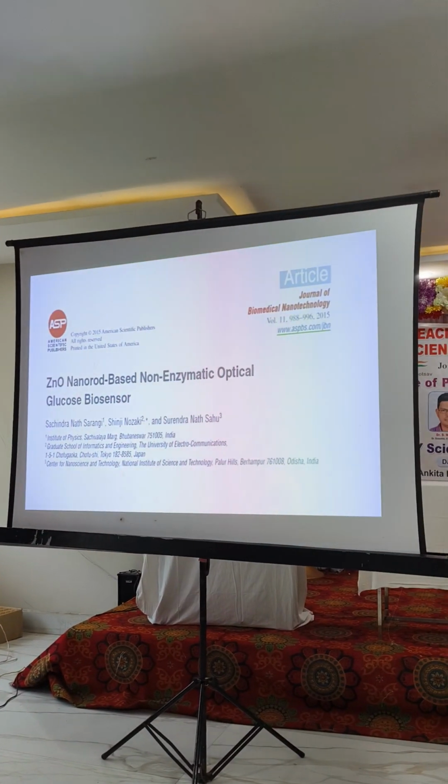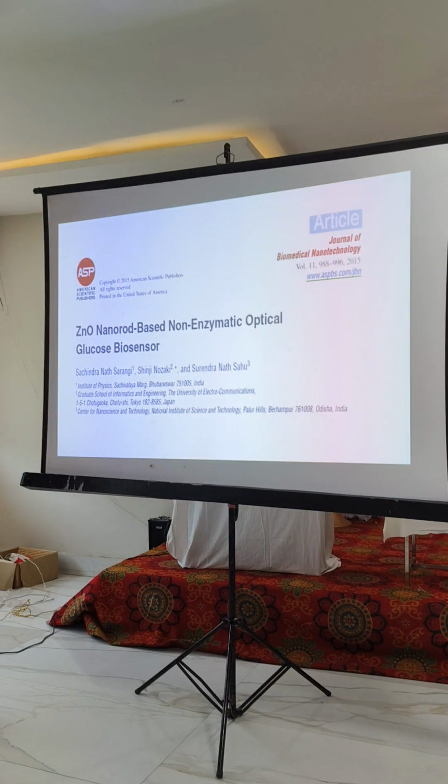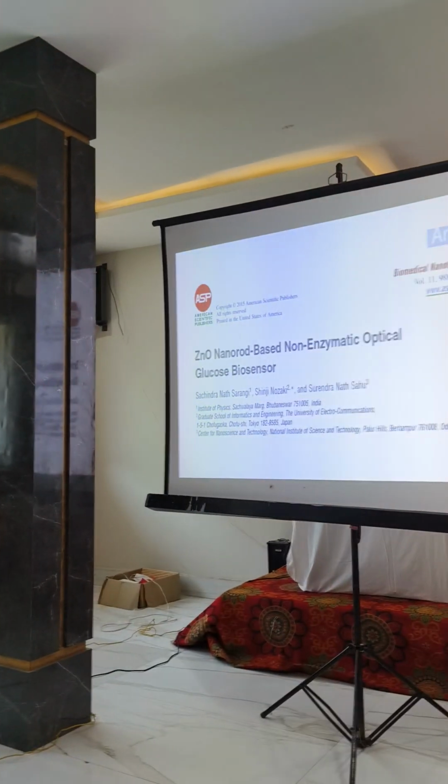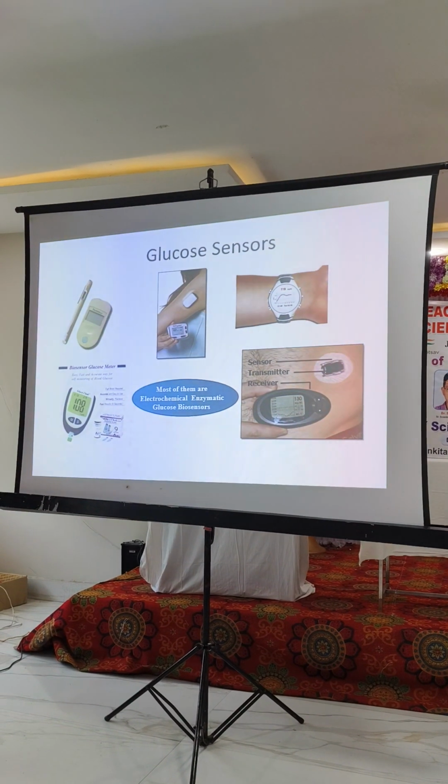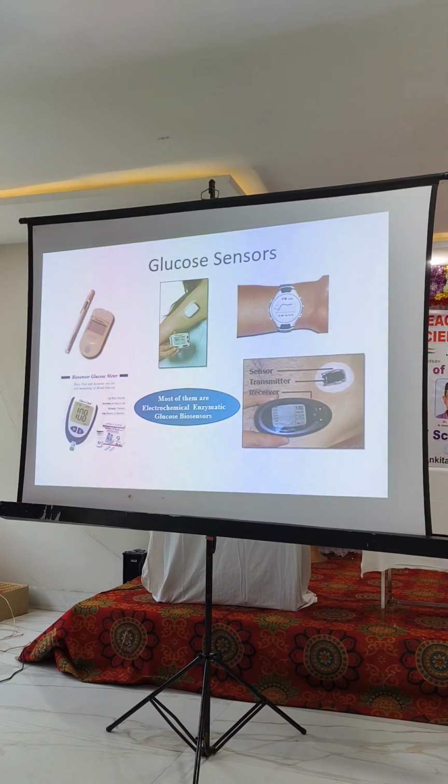Presently used in the commercial market. So what we did, I'll give you a simple glimpse. This is the glucose sensor available in the present market today.